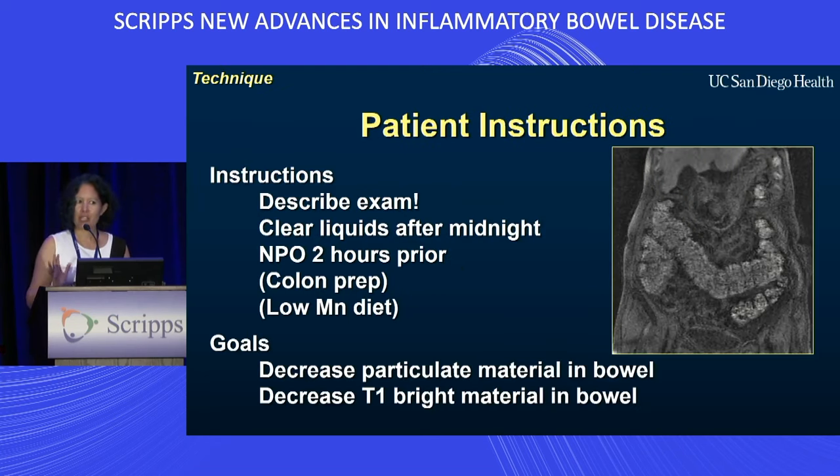So let me tell you a little bit about MR enterography before we dive into what we like to look for and see. I think that the best instruction that the patient can get is from you guys, because they can't walk in and not have any idea of what's going to be expected of them for this type of examination. Many of these patients may have had just routine, regular CT examinations in the past. They think they can walk in and have this done. This is a far more involved examination.